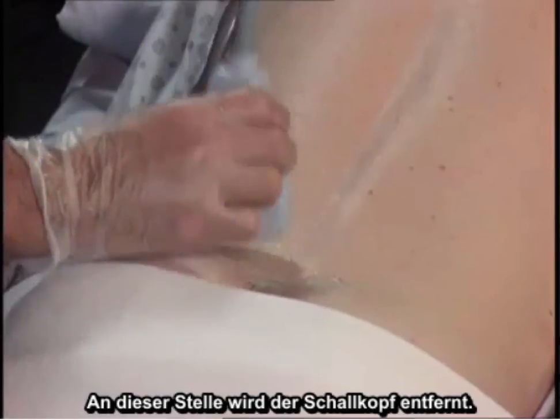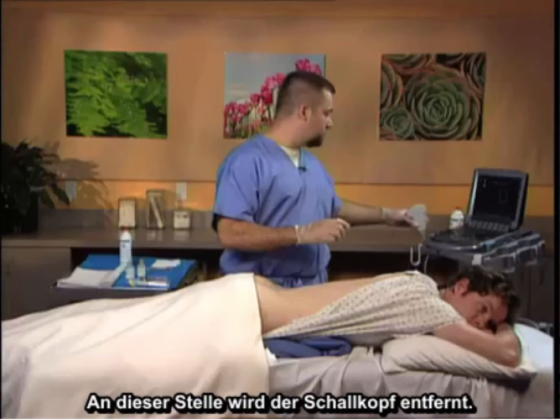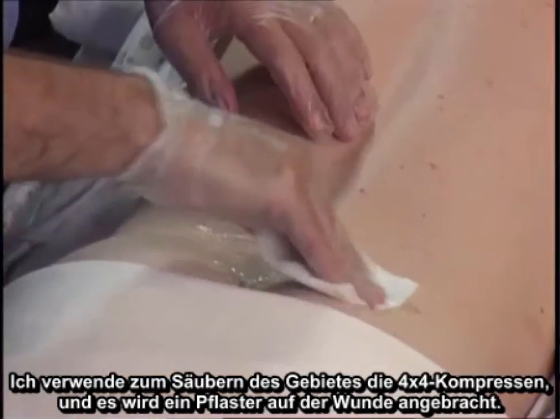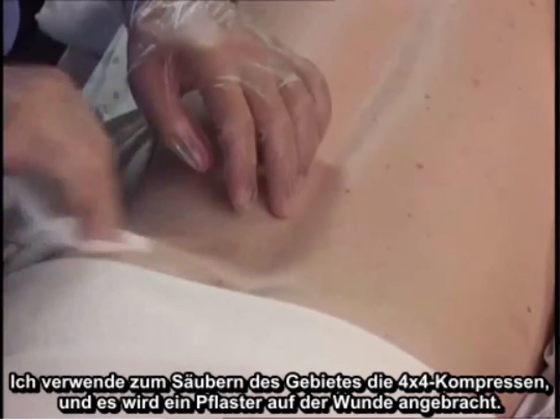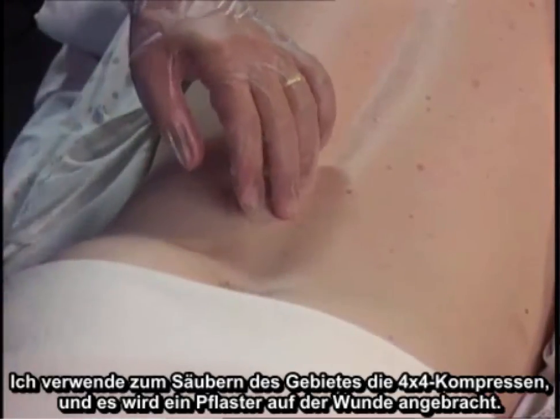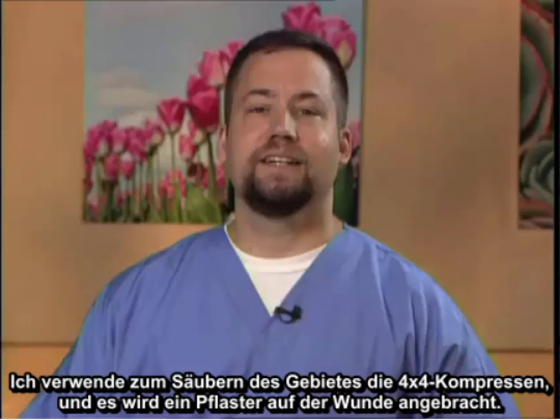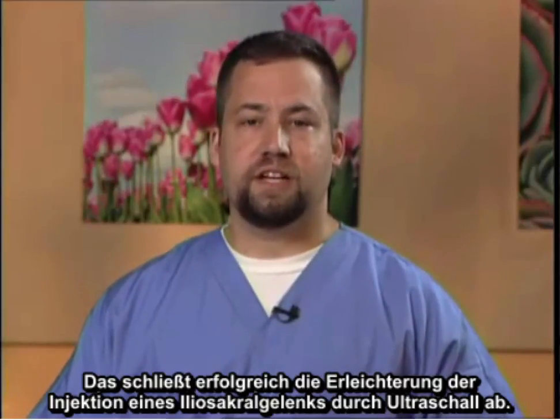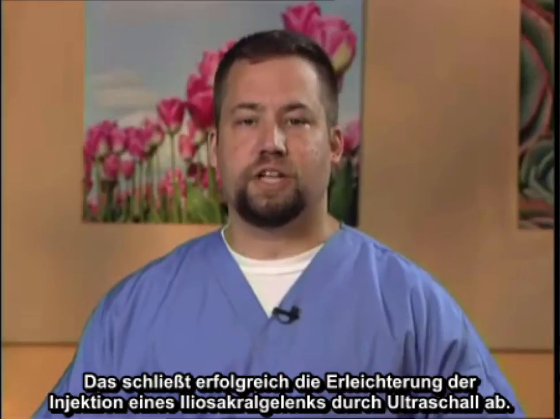At this point, the probe is removed. I utilize the 4x4s to clean the area, and a band-aid is placed over the wound. This successfully completes the ultrasonographic facilitation of a sacroiliac joint injection.